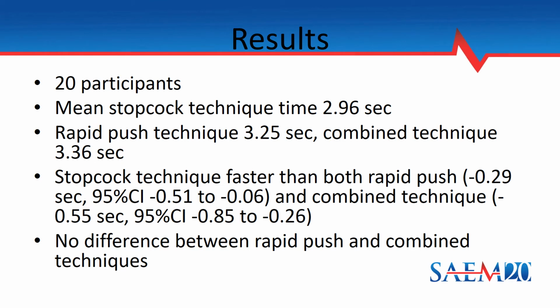Here's a summary of our results. There were 20 participants. The stopcock technique was the fastest at 2.96 seconds and was significantly faster than both the rapid push and the combined techniques. There was no difference between the rapid push and the combined techniques.